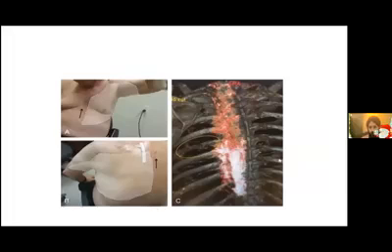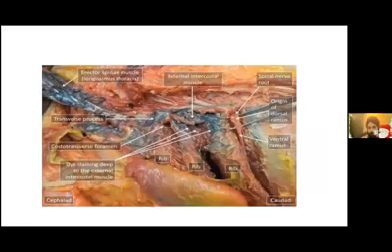This would mostly be the area of hypoesthesia, almost anteriorly till the midclavicular line, we can see. So the vertical as well as the horizontal spread is almost seen till the midclavicular line. This diagram just shows a cadaveric study with dye, and we can see that the dye moves even deep to the external intercostal muscles.